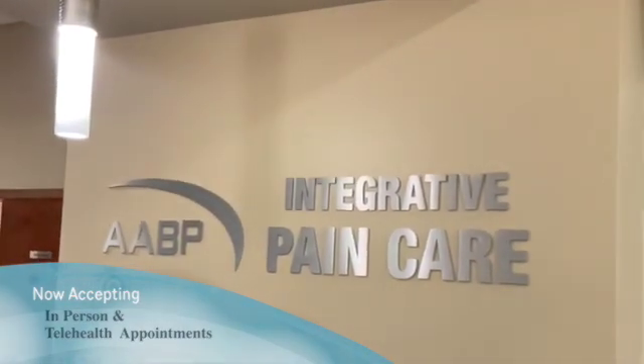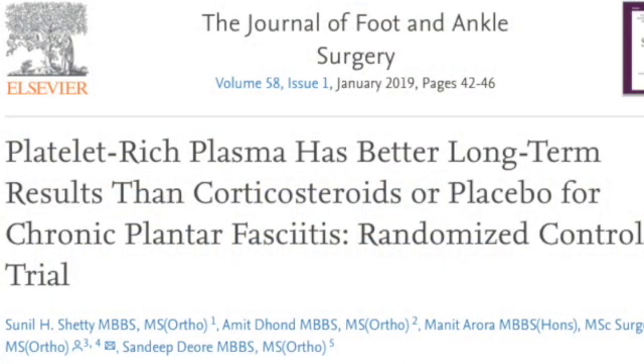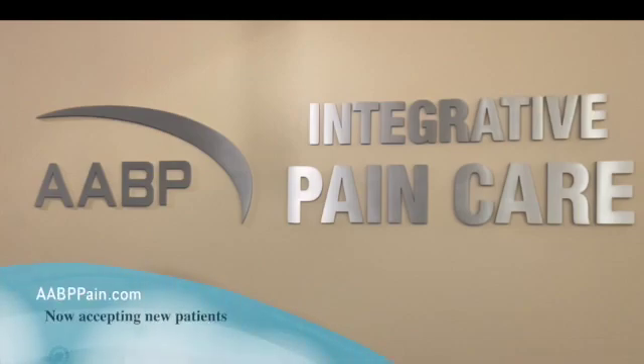This video describes the technique a physician could use for platelet-rich plasma or PRP injection into the plantar fascia. The plantar fascia injection can be painful, and in this video I'm detailing how I anesthetize the region prior to injecting PRP. If you're located in the New York area and looking to see a physician for pain management, you can go to aabppain.com or reach out to me at drosenbloom at rmcpain.com.